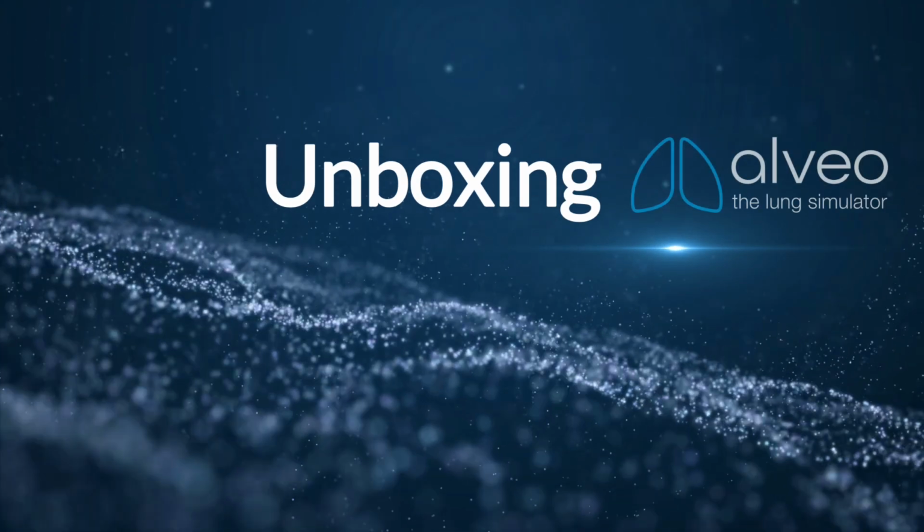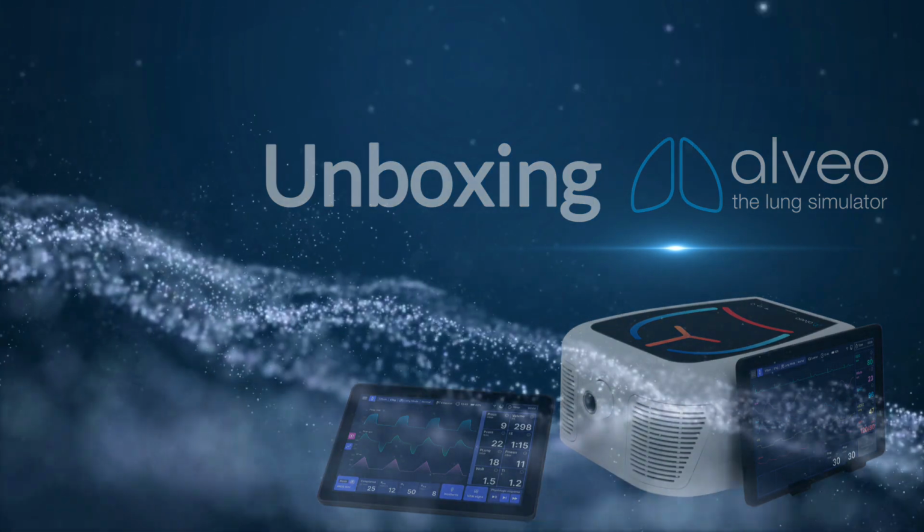Welcome to the unboxing of Alveo, the lung simulator from IMT Analytics.